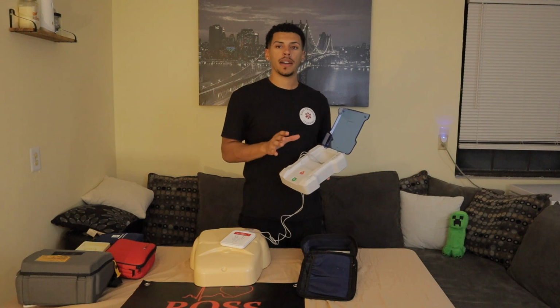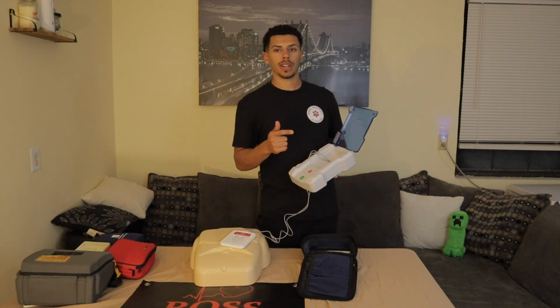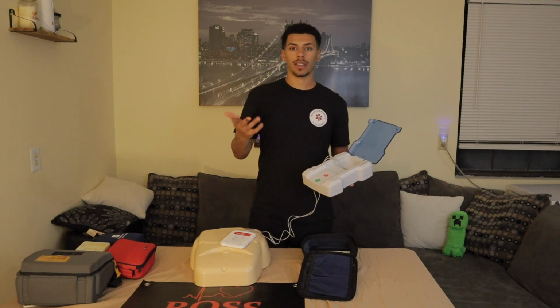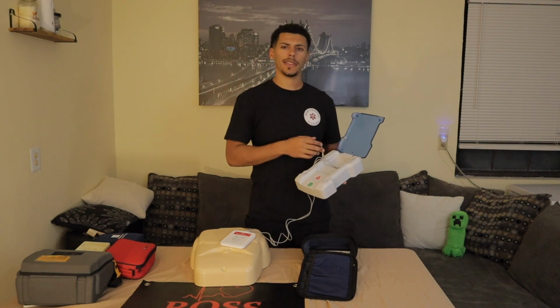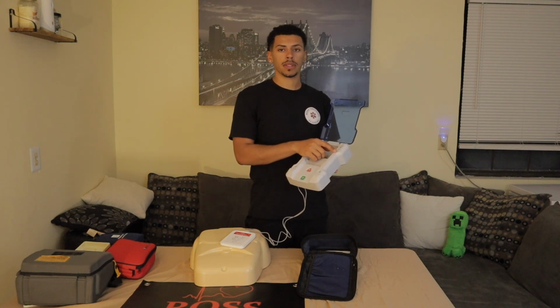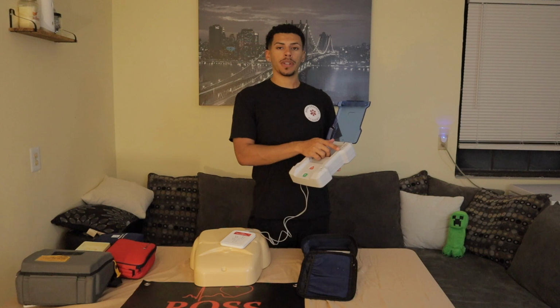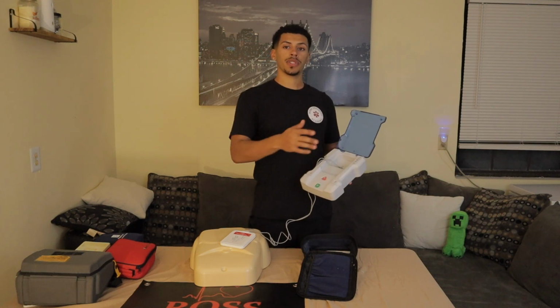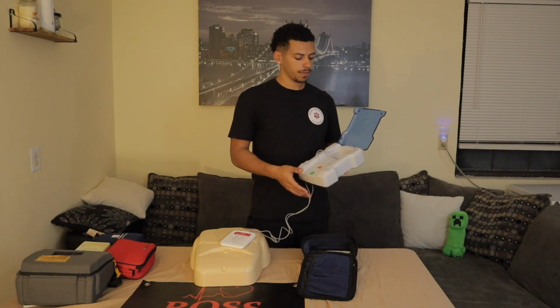Again, I believe there's 5 different scenarios, like shock, no shock, shock, no shock, stuff like that. Then we have our volume, and then we're going to have our pause and start button. As you're running a scenario, you can pause it, tell the students what you want to say, and then resume it exactly where you left off.